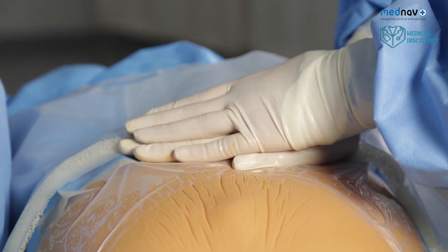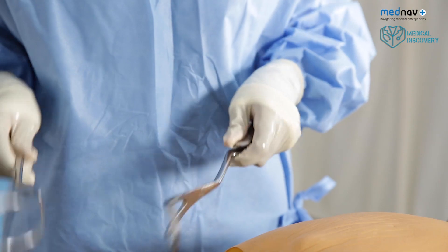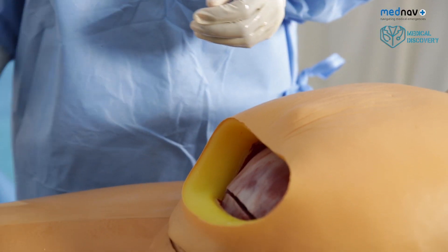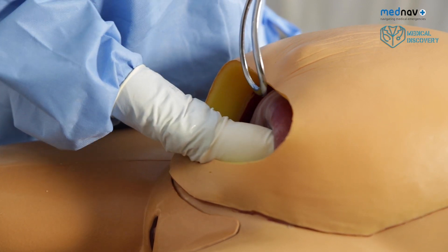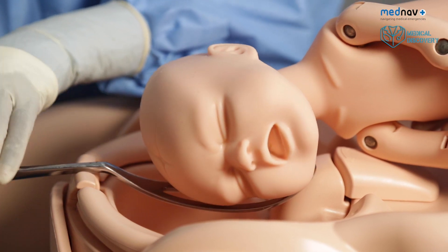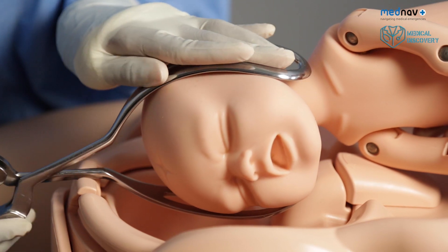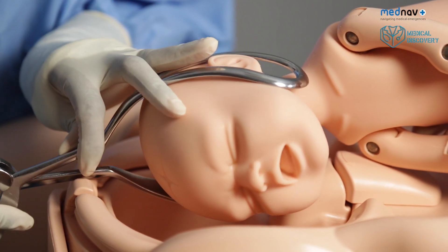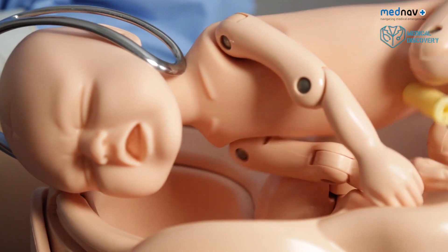If the baby is not deliverable, you can use a Wrigley's forceps. Make sure that you or your assistant has checked that the forceps lock. Stabilise the baby's head and apply the first blade inferiorly. Apply the second blade as you would vaginally. Check that the forceps lock. Apply axial traction and deliver the baby.